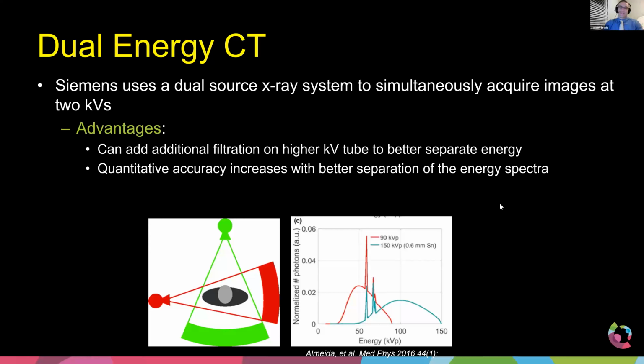Like I said, they each have their benefits. The dual source CT scanner really does a great job with the dose. We showed you in some of the slides, they're only maybe 1 or 2 millisieverts. I mean, 1.5 millisieverts. That's great. That is so low. That's about a factor of 10 lower than it was a couple of years ago.